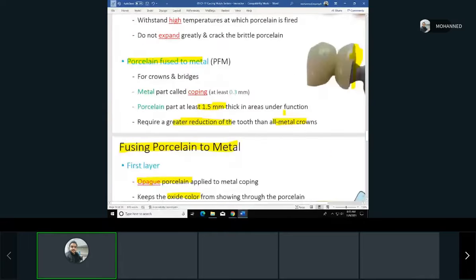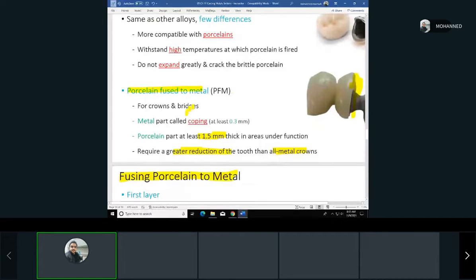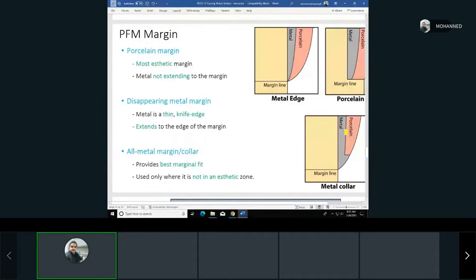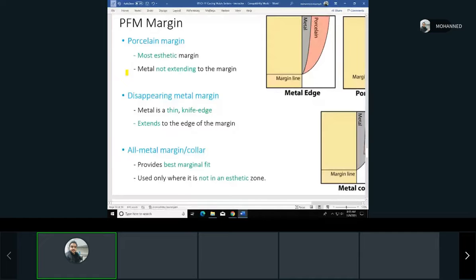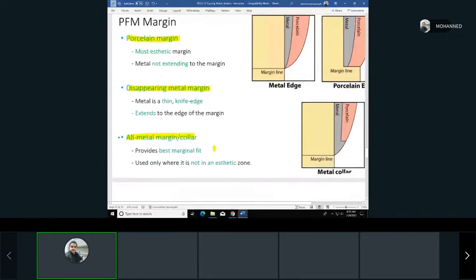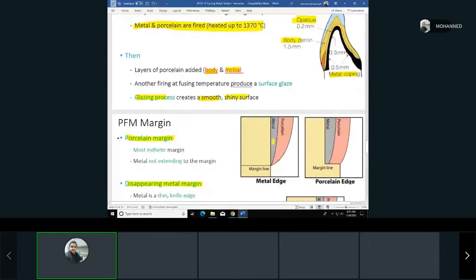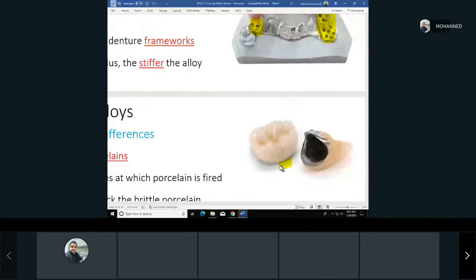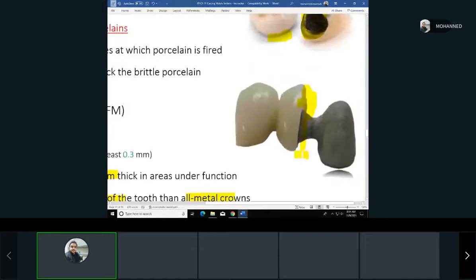So we talked about the actual porcelain fused to metal crown, what it's made of and how they layer it. Now let's talk about the margin of the porcelain fused to metal that will fit on the tooth. We have three types of margins: a porcelain margin, a disappearing margin, and an all metal margin. When you look at these here, on some of them, for example this one, we still have a metal margin on the bottom, because the metal margin will fit a little bit better. Here, they didn't leave any metal margin. That's all porcelain.